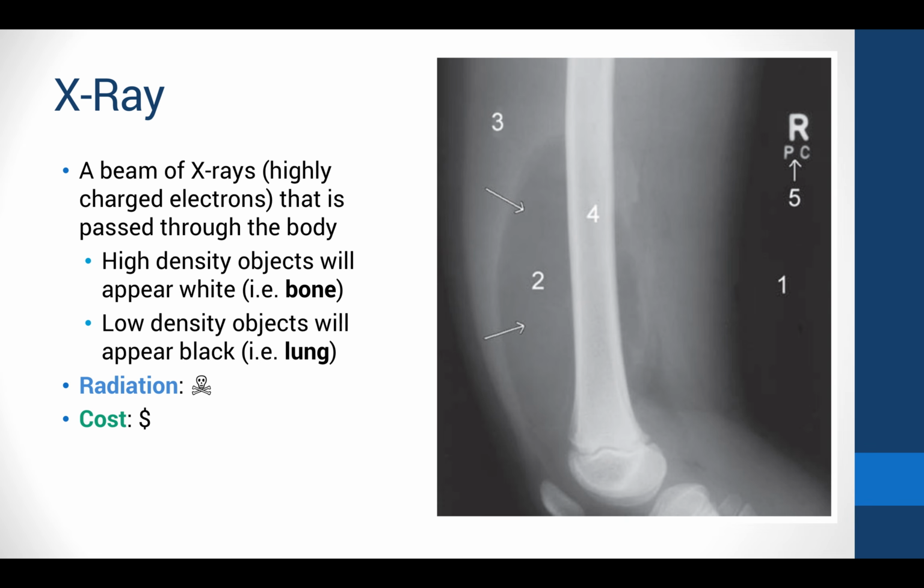In terms of cost, X-rays are a very, very cheap test. So the combination of low-level radiation plus low cost gives us a pretty quick, easy test to do as a quick snapshot, an easy way to look at something and say, okay, what else do we need to do to maybe get a better look at this image? It's kind of our initial snapshot, our initial picture of what we like to take a look at and then eventually make decisions on moving forward.